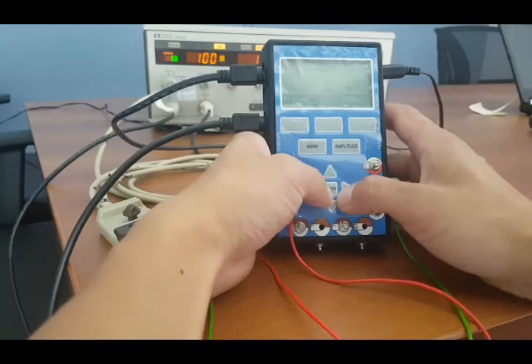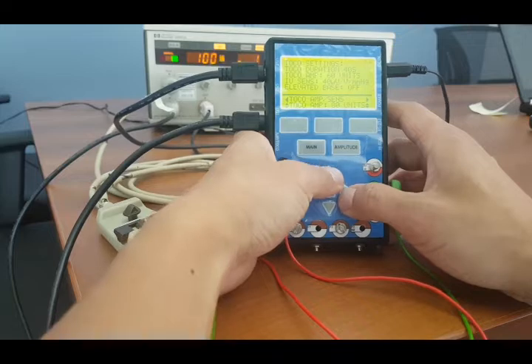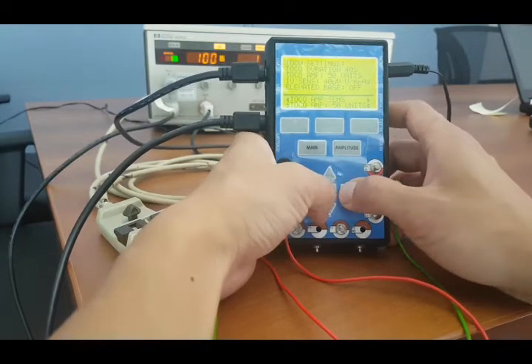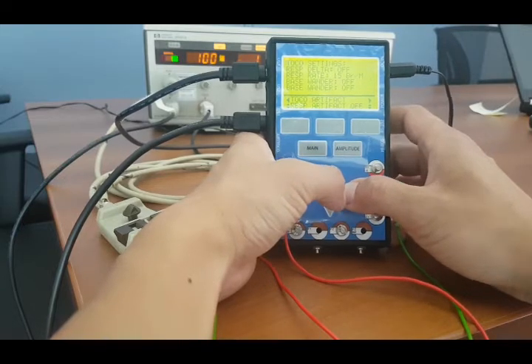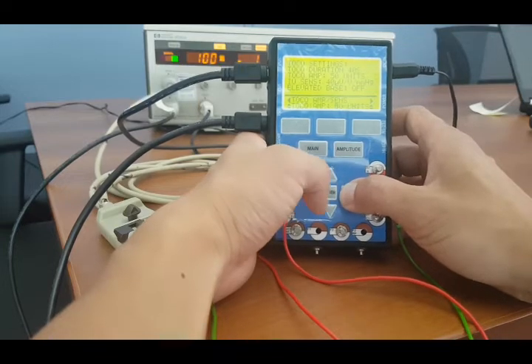If I wanted to change the sensitivity, I can change that from 60 units to say 50 units. Simply hit enter. I'm going to keep my waveform as is. There are artifact options, but for this demonstration I have turned them off.